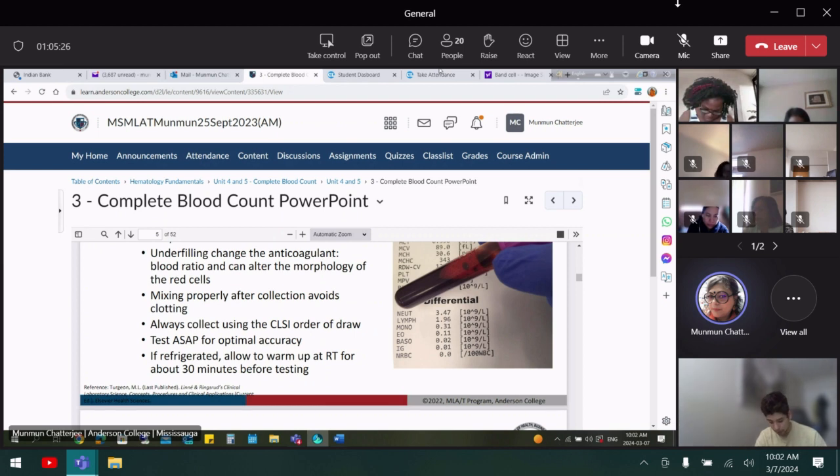So that's why these are more advanced analyzers. Like before you used to use the CD for the computer. Now the CD has gone. You are using the USB. After USB, you will see something else. Like that, things are transformed and more advanced. But for the MLT it is the SST, exactly. But you should have the knowledge of why you do that.